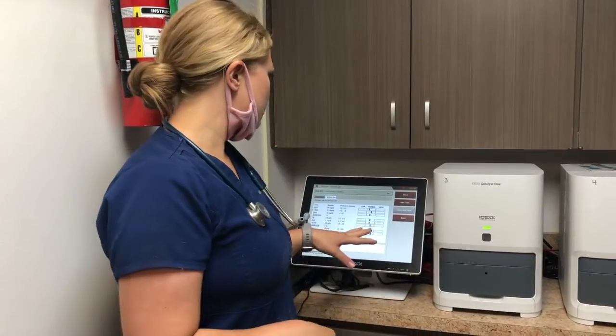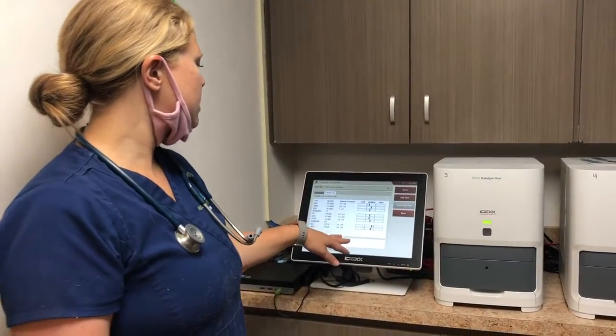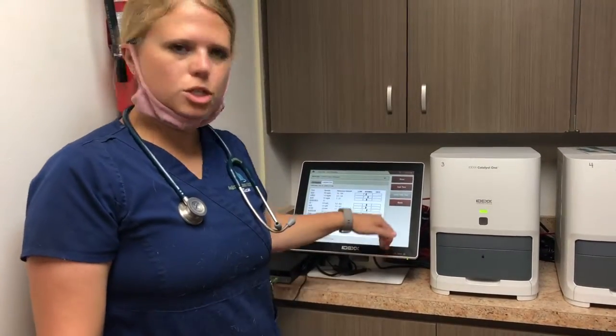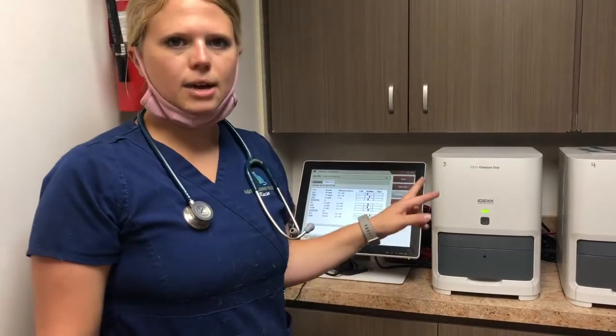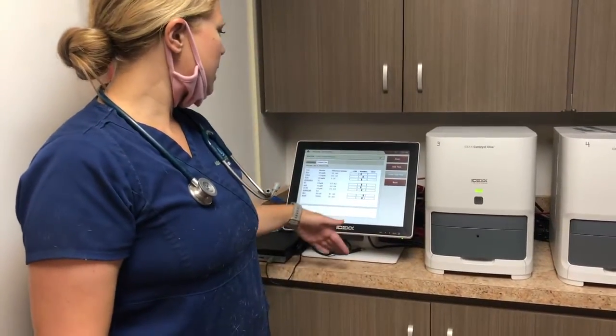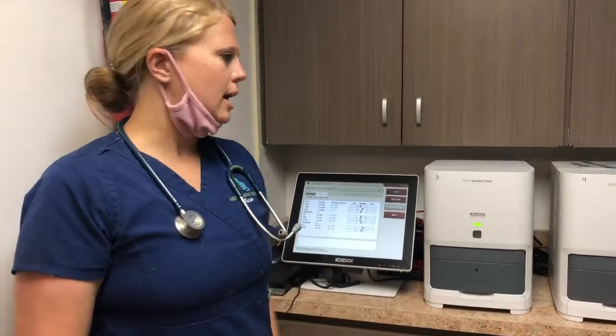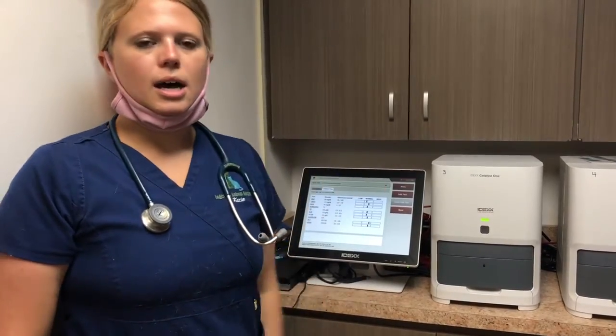Now that our test has finished running through for our Chem 10 chemistry panel, it does pull up the results here. Anything abnormal would show up kind of on the outside lines in red, saying it's not within the normal limits. Everything with Baxter all looks good within the normal limits. The doctors will review that. This is for a pre-anesthetic procedure, and so they would review and then move forward as needed.